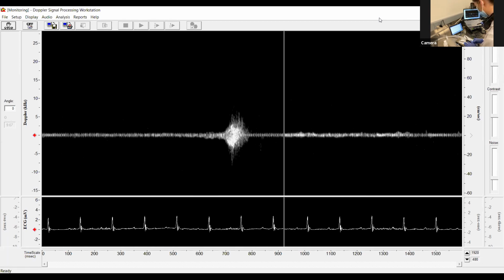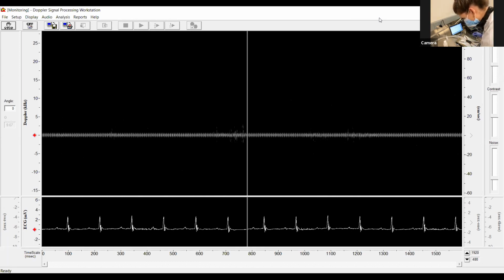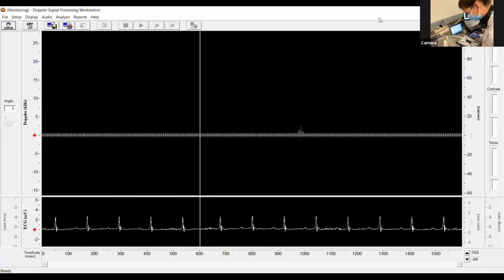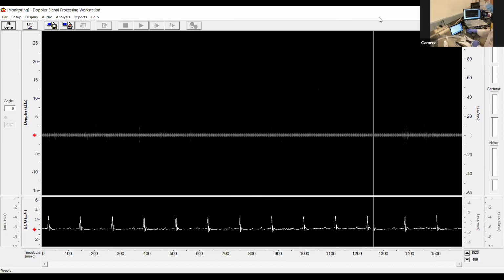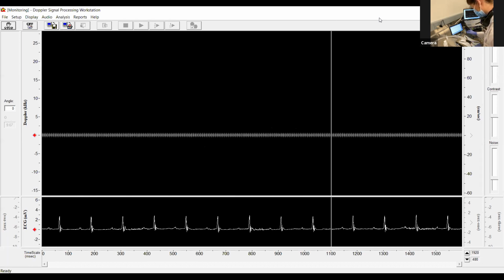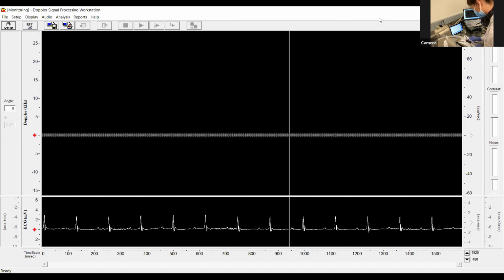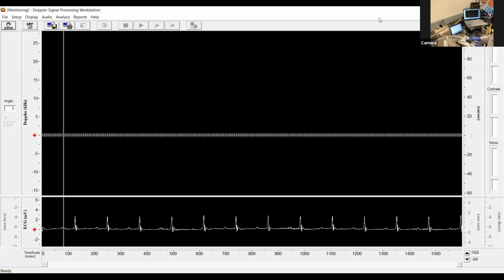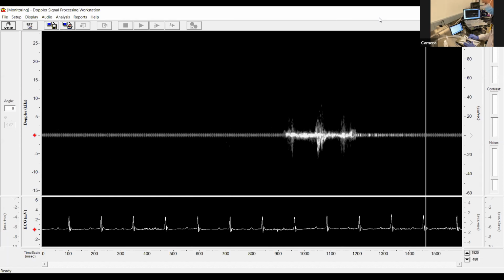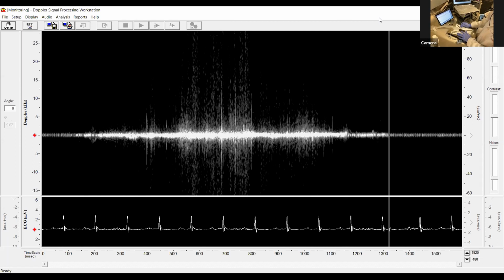Do you want to try and do coronary instead? Okay, so let's, yeah, coronary or aortic outflow, you pick. Okay. Coronary, okay. So Sydney's now going to move and do the coronary artery. So here we're looking at the left anterior descending coronary as it comes out at the aortic root. So if we know our anatomy, the aortic root, the left anterior descending, the LAD comes out quite nicely straight out, and it would actually be going almost straight towards the armpit, basically the left armpit of the mouse.